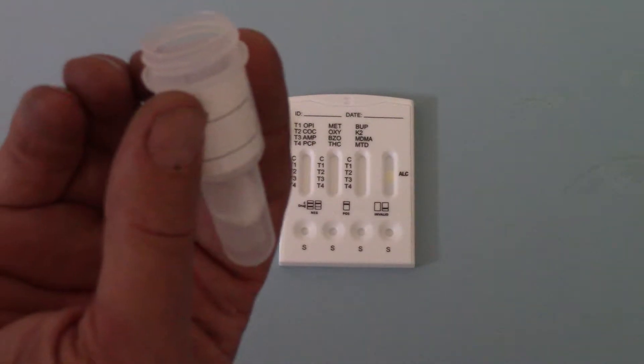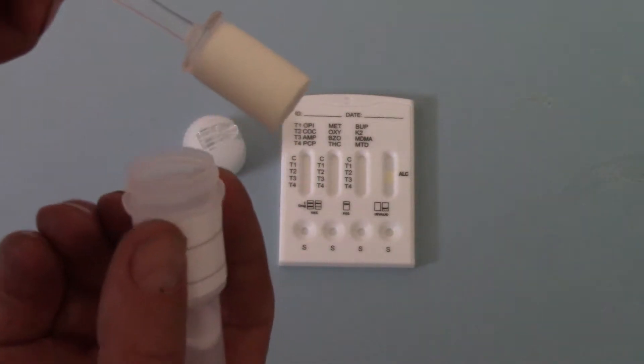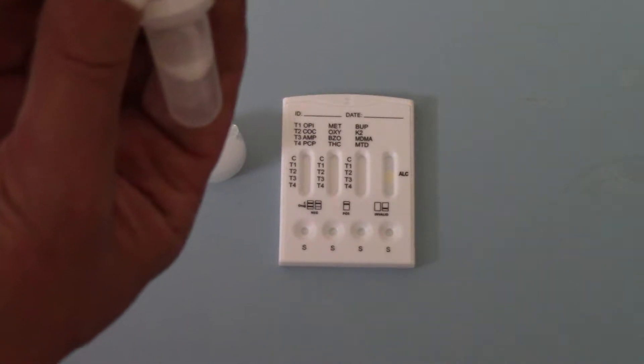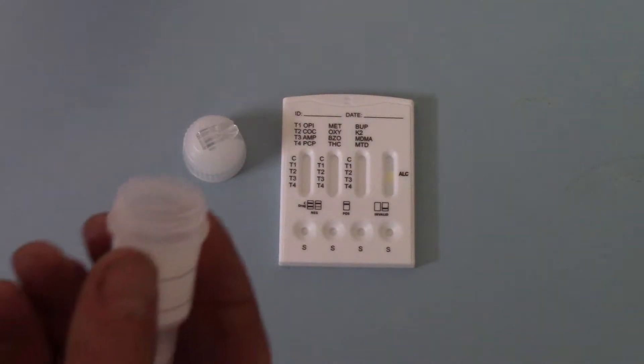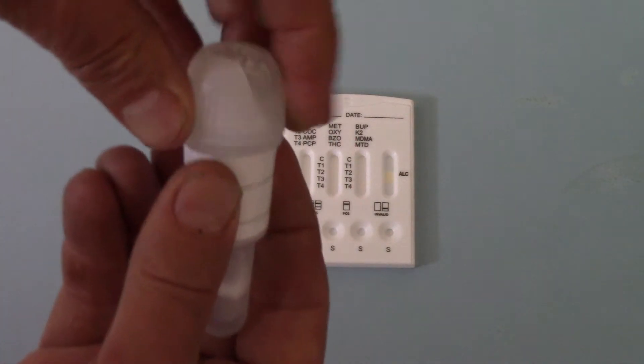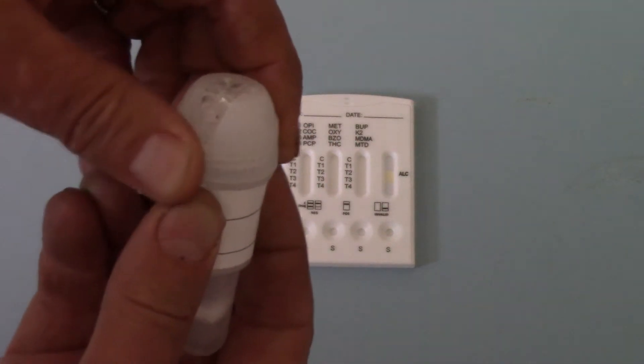These swabs don't tend to compress so if there isn't adequate saliva being obtained in the bottom of that bulb, you can ask them to put that back into the mouth and to feed saliva onto it to get an adequate sample.